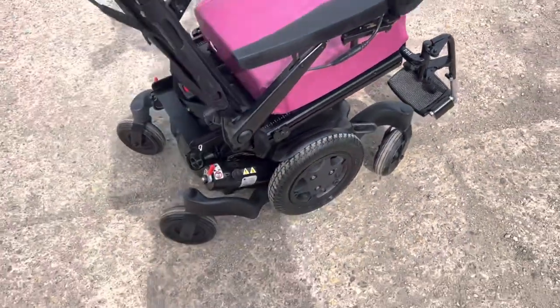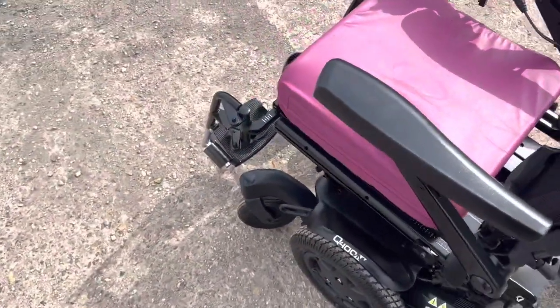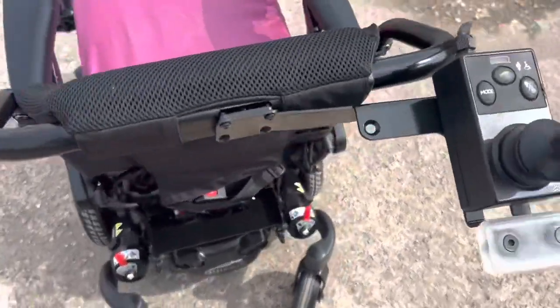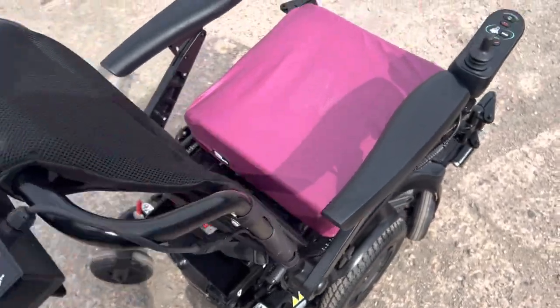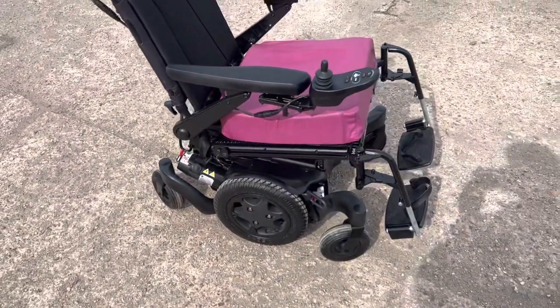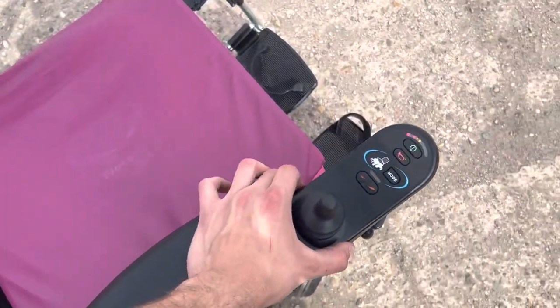You're not going to find too many in this condition. We do lots of refurbished models, so if you want to leave a message in the comments below, let us know if there's any particular chair you're after — we can probably even source it for you.